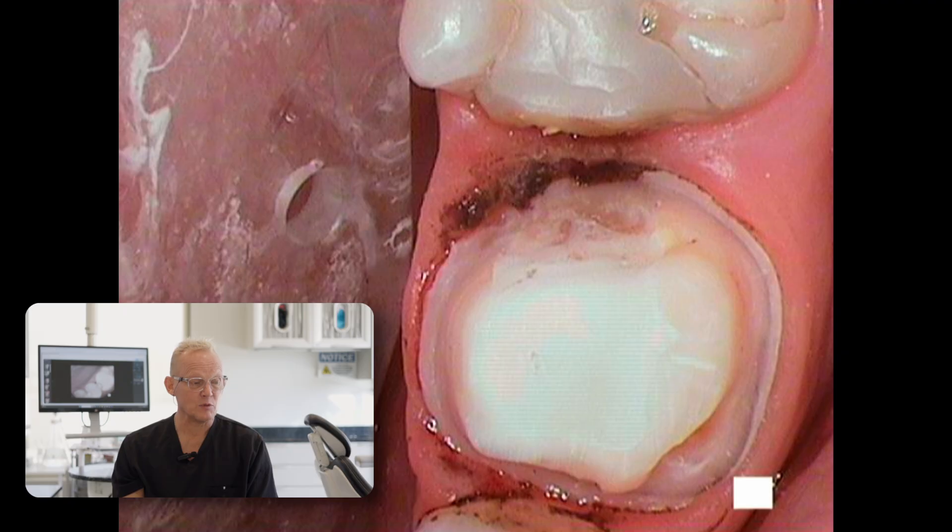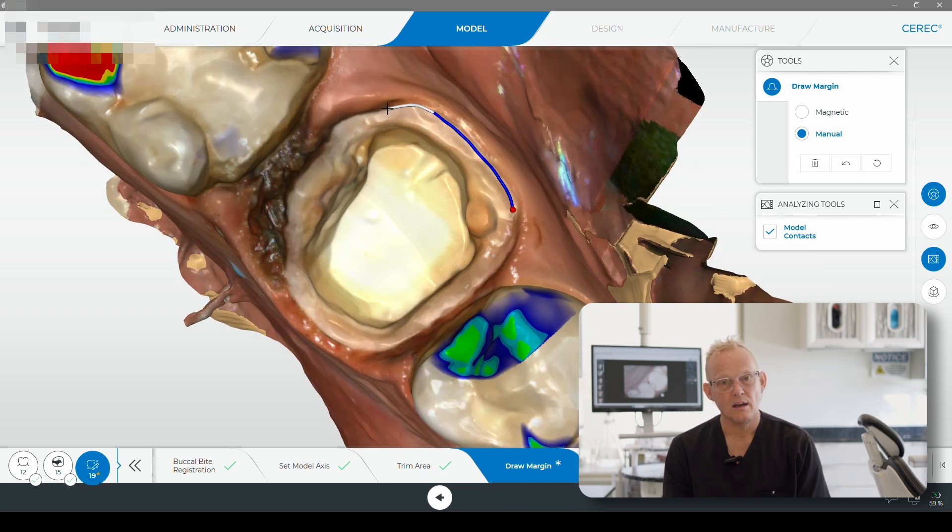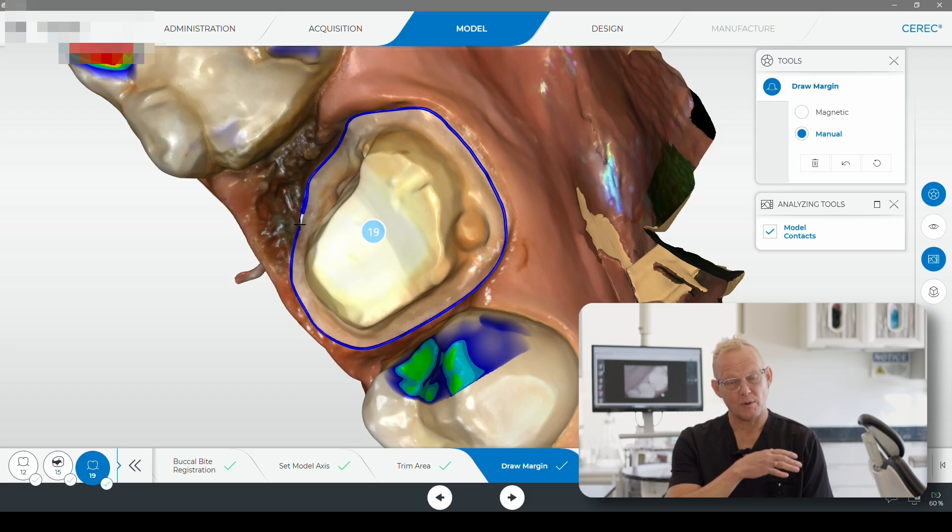Partial crowns are a very conservative way of restoring a tooth. A traditional crown prep — which I did on one on the lower jaw — involves grinding down a lot of the tooth structure and capping the whole tooth to give it strength and bind it together. But if we can be conservative and do a partial crown, that is even better because we're keeping as much tooth structure as we possibly can.